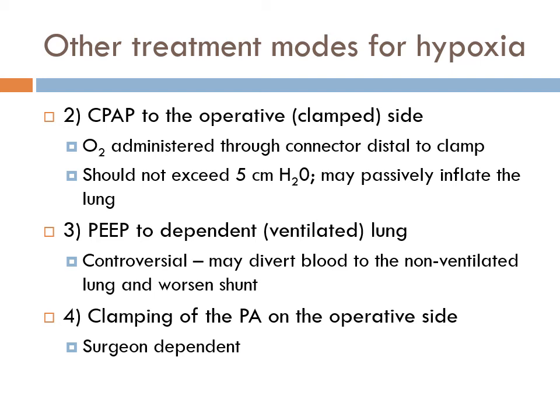I'm struggling in this case. I'm trying to oxygenate this patient. I don't care if they fix the patient or not, they're going to have problems, right? They're not going to oxygenate and it will cause ischemia. So what I can do is, instead of keeping this closed, I can put on the Mapleson circuit. We have Jackson Rees in pediatrics, and having a pediatric bag actually works really well because it's a small bag that you can see physical changes in when there's air in it. I'll tell you why. It doesn't have to do with CPAPing, but we can hook the bag up to here, and this is kind of the ghetto way to do it.